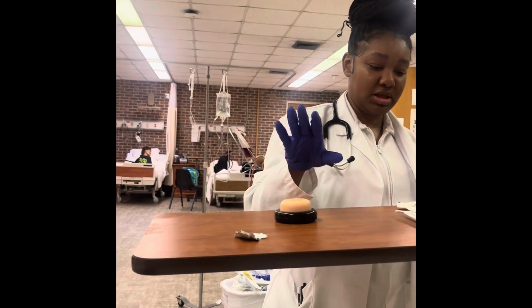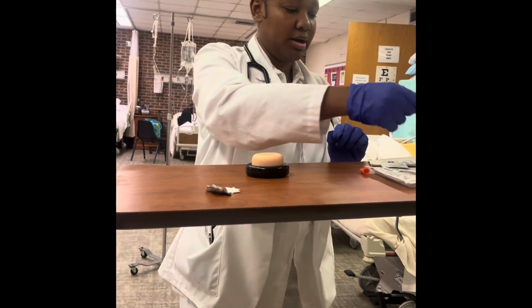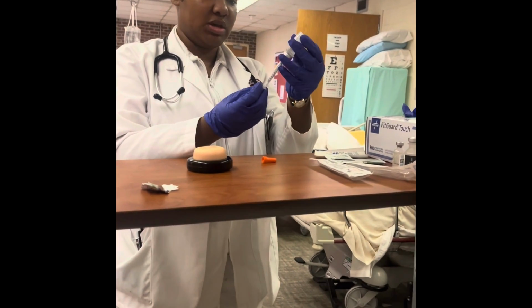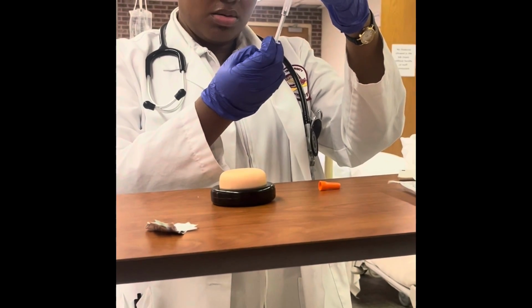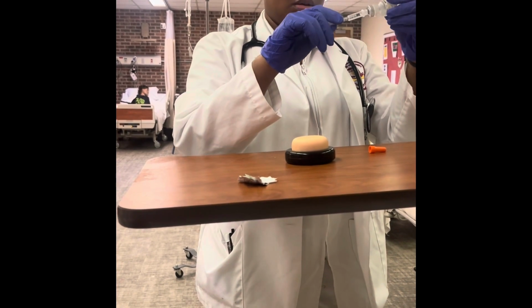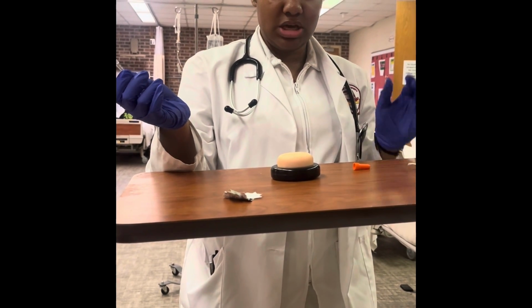And as I'm letting that dry, I can go ahead and pull up your medication if I haven't already. For instance, insulin would probably already be pulled, but just to show how I give my medication. Be careful because the insulin needle is really delicate, it bends easy. Pull my needed medication. Aspirate. Make sure I got all the bubbles out, air out. All right. That's dry now.